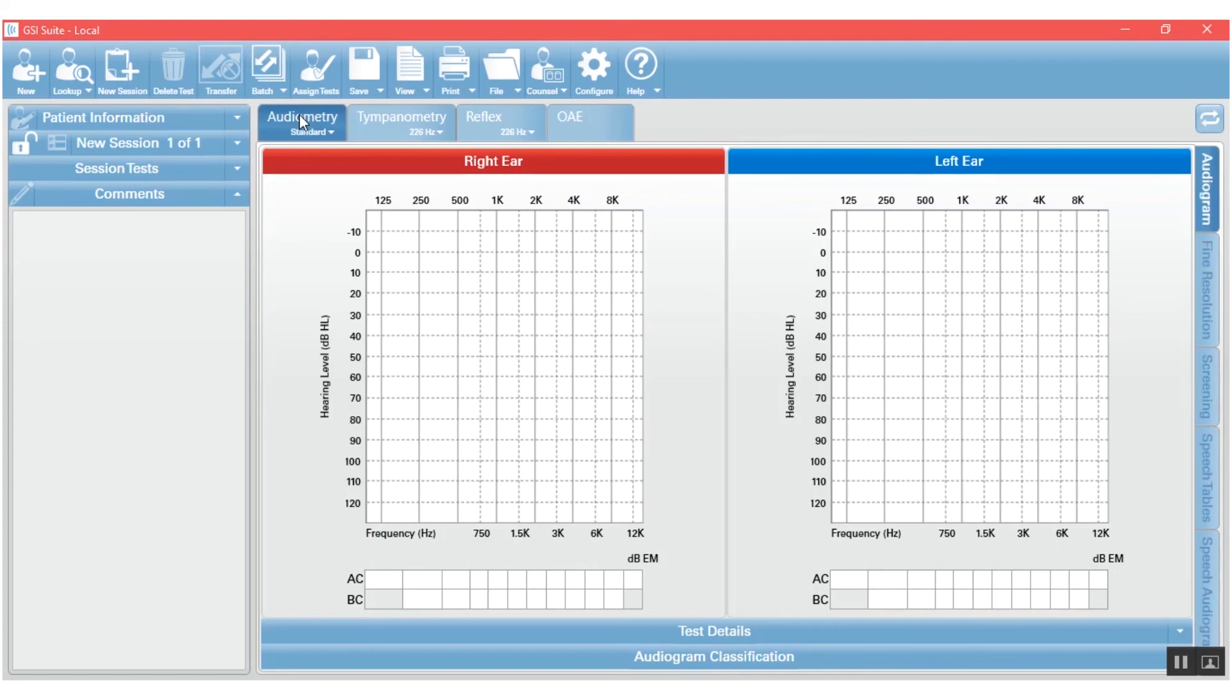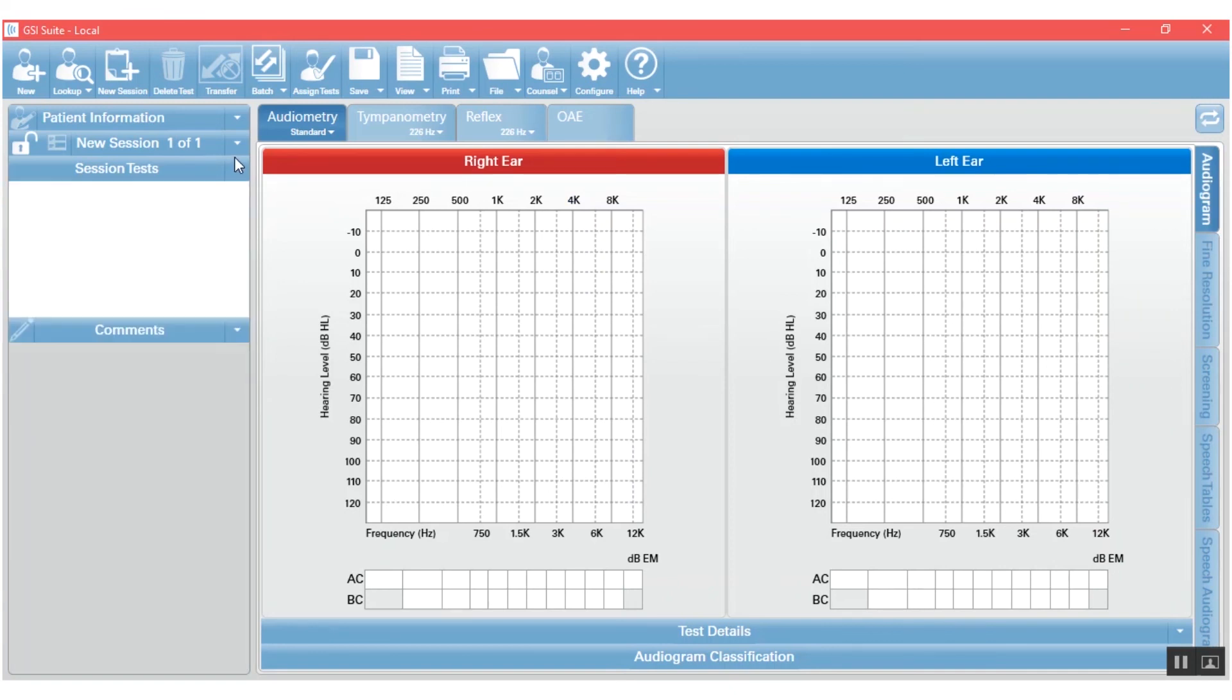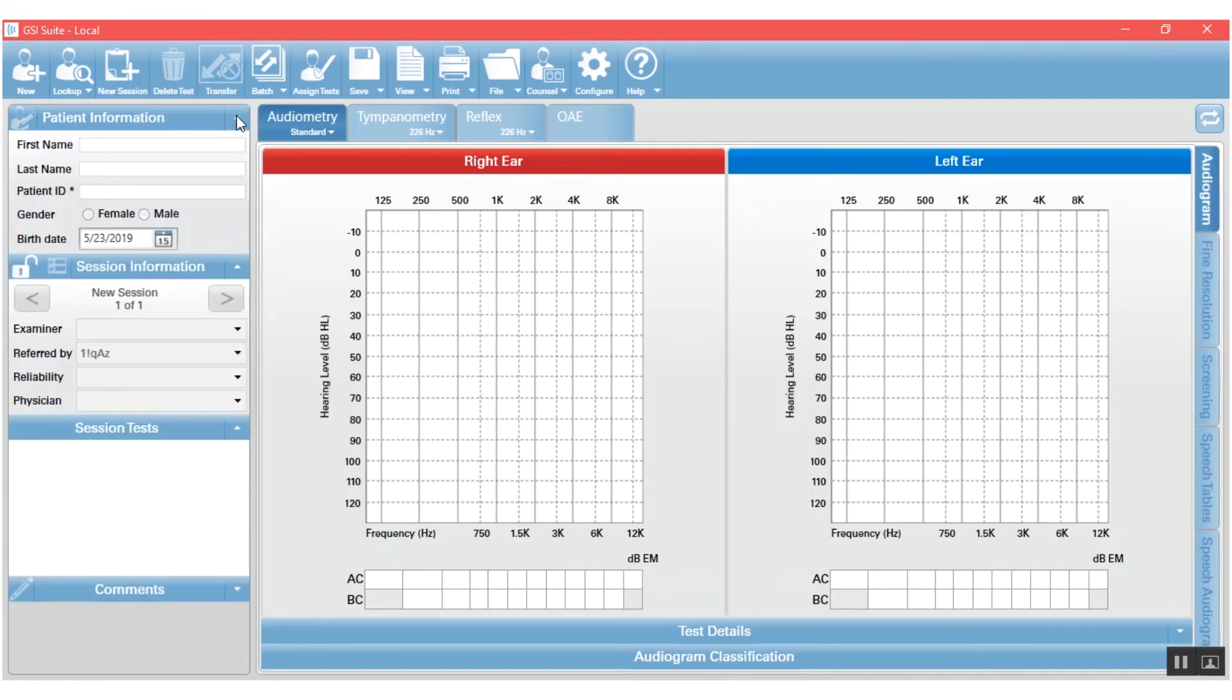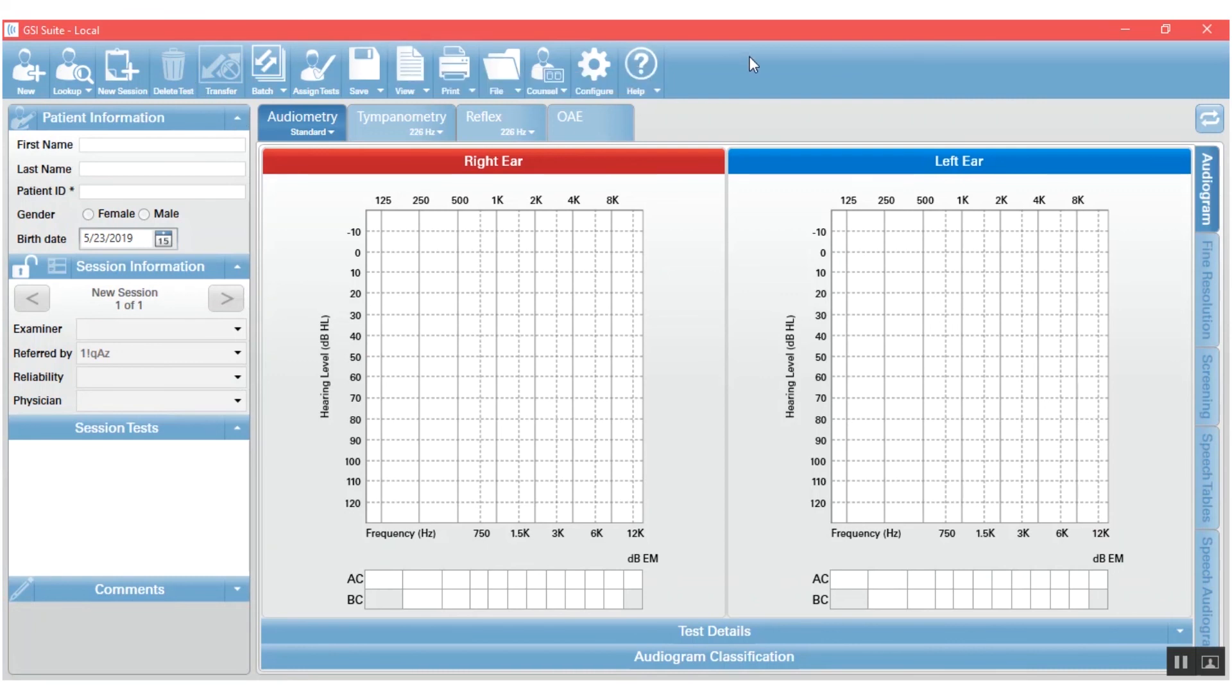So at the end of your entire session, you will have data in this middle area here. You will have maybe comments, maybe some session tests, maybe some session information and patient information that you'll be able to manage with this top ribbon of icons here.